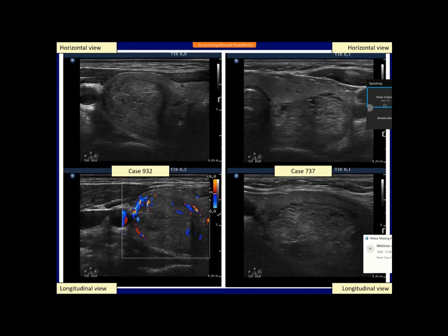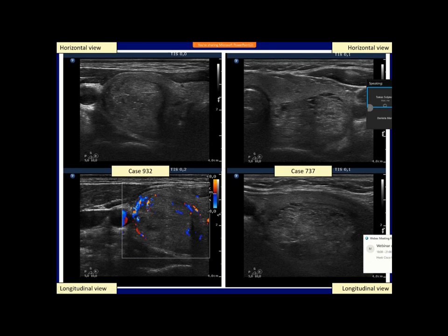In larger lesions, it is more difficult to visualize the complete ring in the same section. In the left nodule the halo is almost complete, but in the right case the halo can be seen only in part of the circumference. It may be partly explained by technical reasons. Here we can see the halo sign, but at the dorsal part of the nodule it is much more difficult to visualize. Both cases proved to be follicular adenoma, and therefore they had to be surrounded with a capsule.